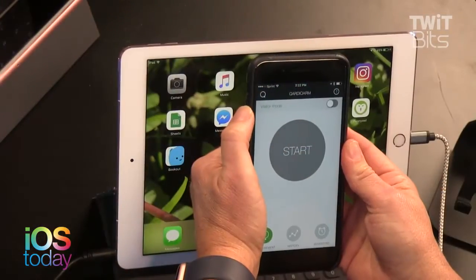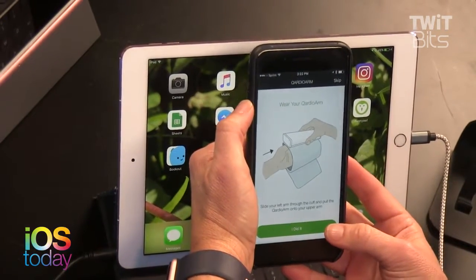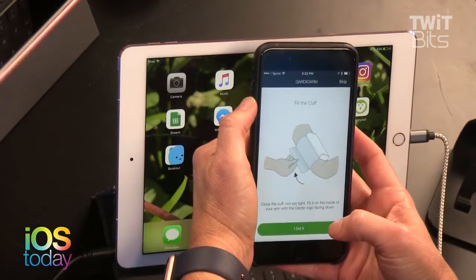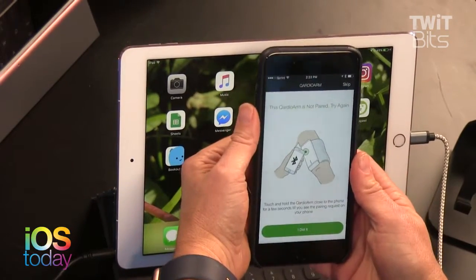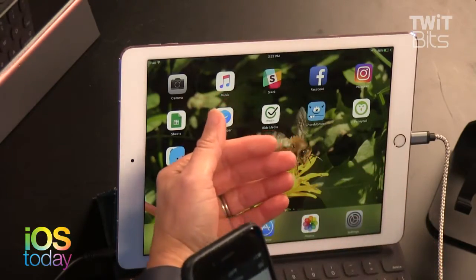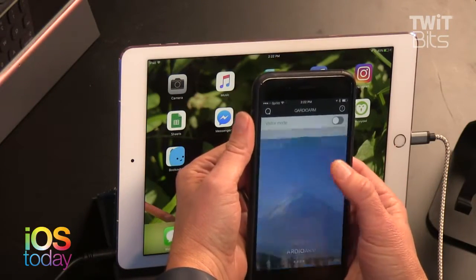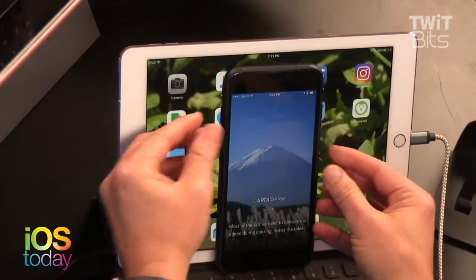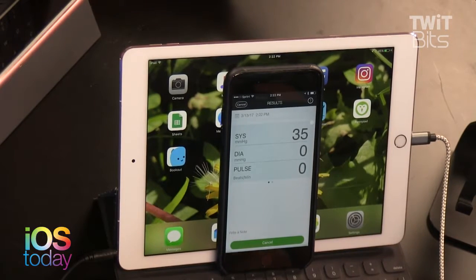I'm on medication for high blood pressure, which is one of the reasons I'm aware of this device. The app tells you where to place your arm — feet flat on the floor, arm at heart level, no fabric under the cuff — to get an accurate result. I started a reading. It says 'pairing request.' It paired with yours actually — paired fast. That's your blood pressure it's measuring.